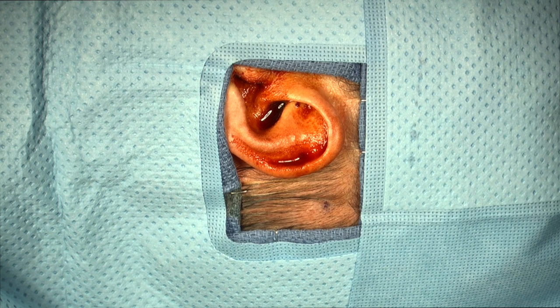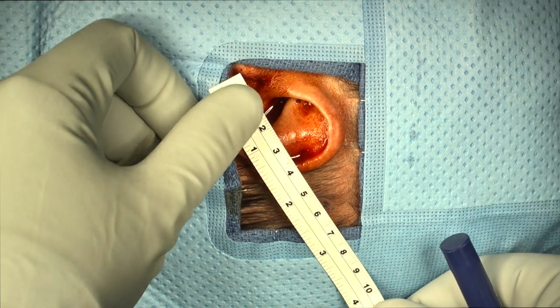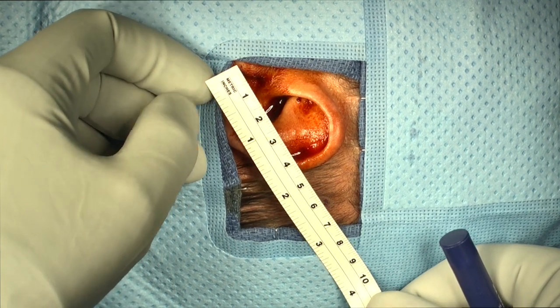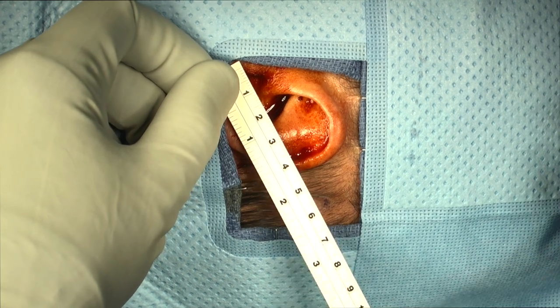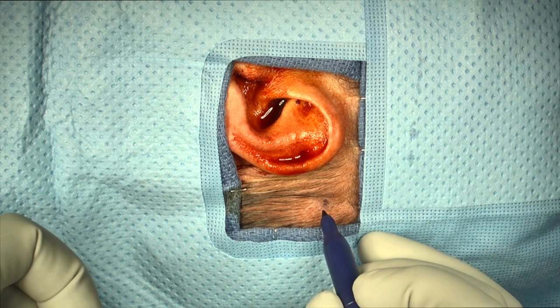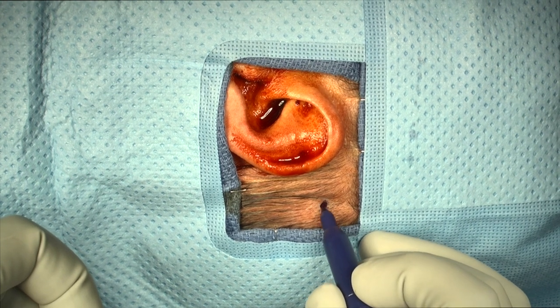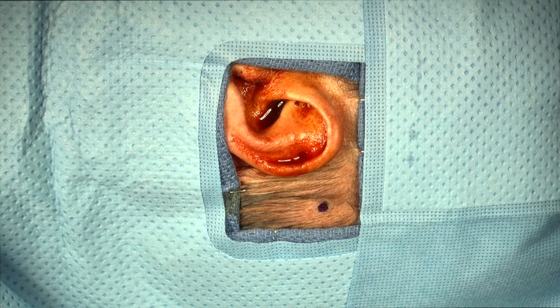This is an adult patient with single-sided deafness; we are operating on the left ear. The first step of the procedure is to mark the location for Baha placement. This is generally about 50 to 60 millimeters posterior superior from the external auditory canal meatus along the temporal line. The temporal line is best suited for screw placement because of its rather thicker bone — it avoids the mastoid air cells and the thinner squamosal temporal bone located superiorly. It's important to ensure the surgical site is not placed too close to the pinna.